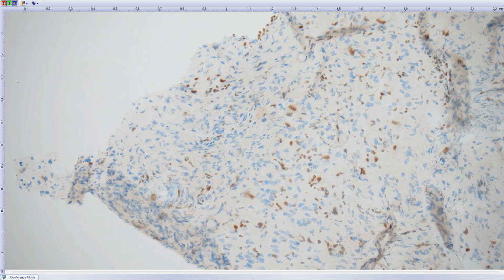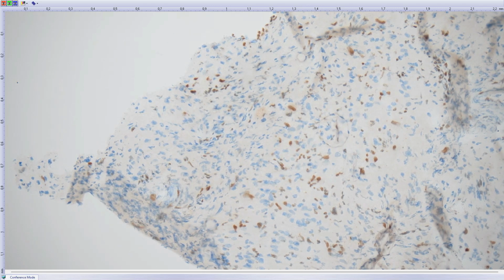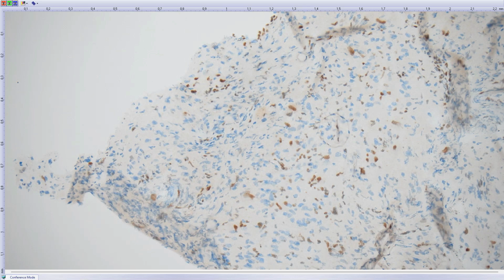And I had a suspicion for another tumor type, which is called high-grade astrocytoma with piloid features, which in most cases presents with a quite low-grade histomorphology, but in fact is a high-grade astrocytic lesion with dismal prognosis, only a little bit better compared to classical IDH wild-type glioblastoma. So how can you make the diagnosis? You can do it only by methylation profiling, and indeed methylation profiling came back as high-grade astrocytoma with piloid features.